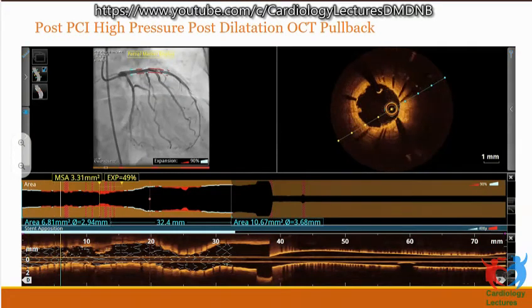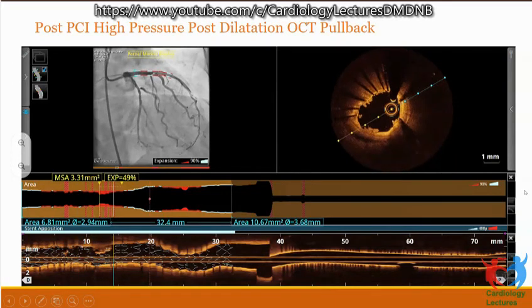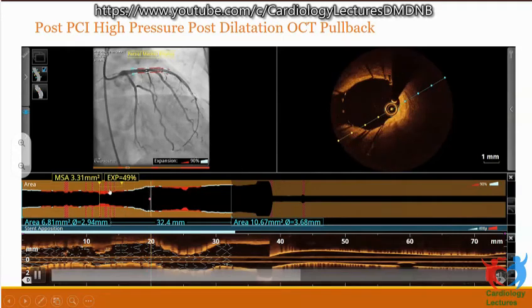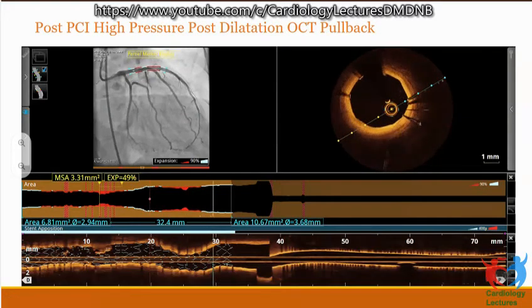So the patient underwent high pressure post dilatation and they did the OCT. And if you see the cross-sectional image, it's absolutely studded with the white thrombi. So these are at times a little scary. And despite a well-expanded stent, you'll get these red markings. These are probably because the stent appears to be under-expanded because it is fully covered with thrombi.